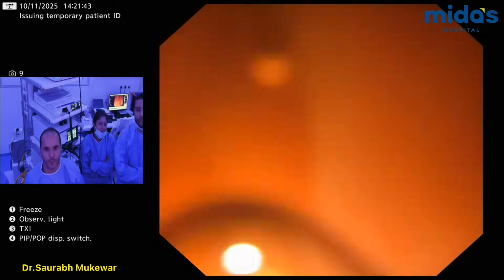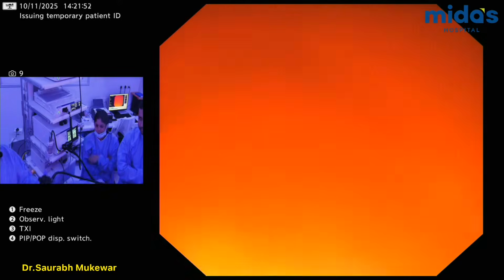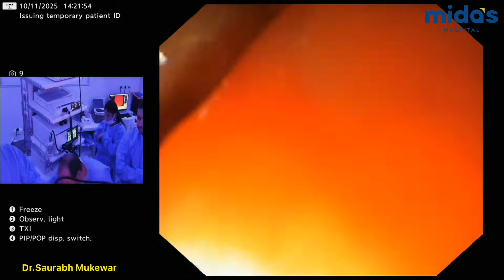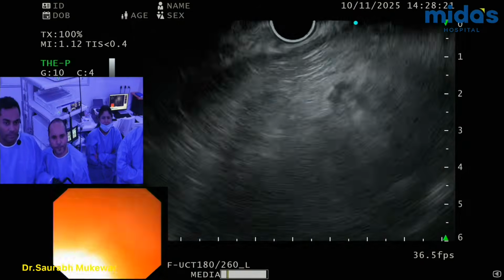Alright, where are you, in the antrum? I'd say first week for you, don't worry about that. Just do a basic exam of the stomach. No, it's okay. You got it. Just the basic exam of the stomach. Transgastric assessment of the structures. Alright? Pull back here.